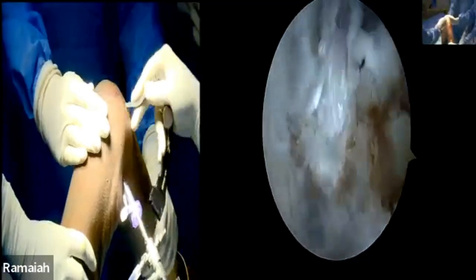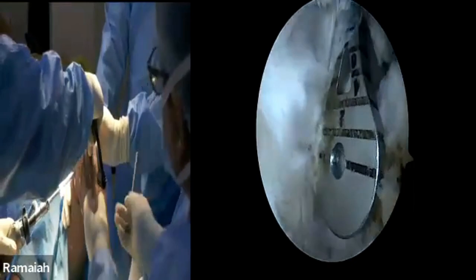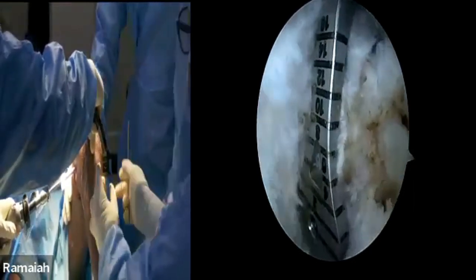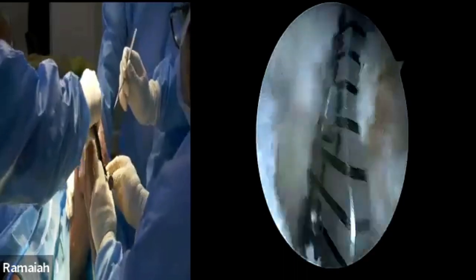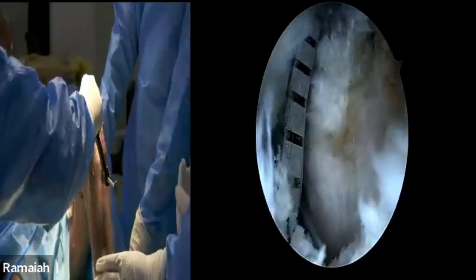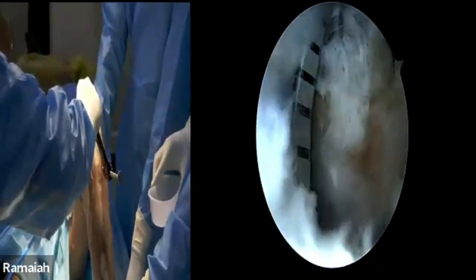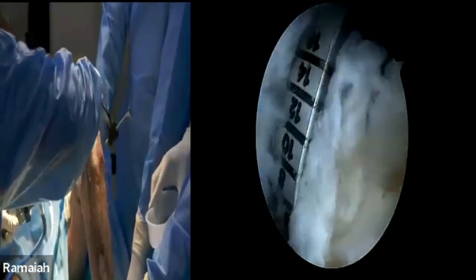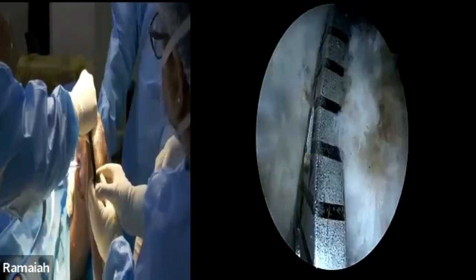This is the PCL jig from Arthrex. I'm coming from the anteromedial portal. The jig has a marking — it's already at 15 mm. How medial and lateral to position is another question. If you see the medial-most border of the PCL fibers and stay on that, you're right, or try to stay a little on the lateral side. It's around 16 mm and we are sufficiently down — Dr. Prathima will come with the jig.